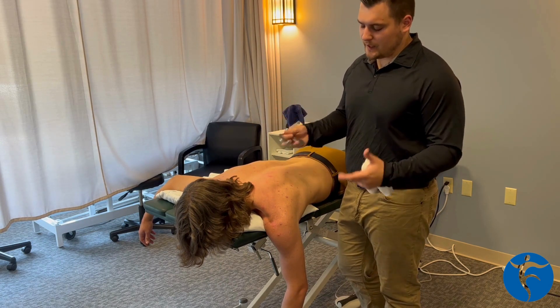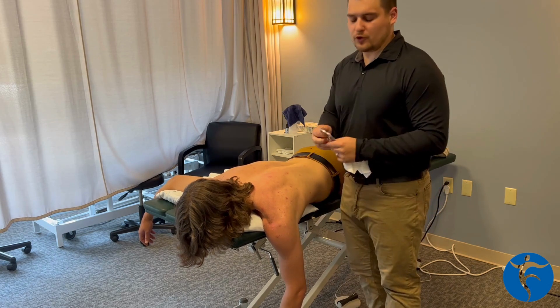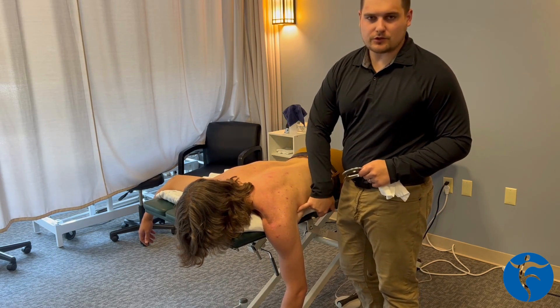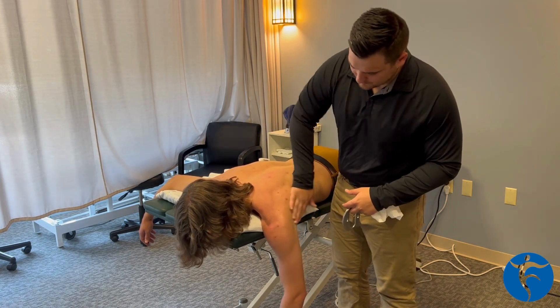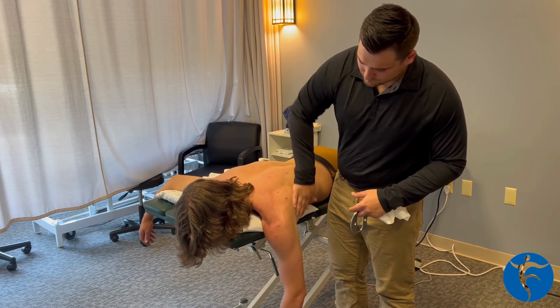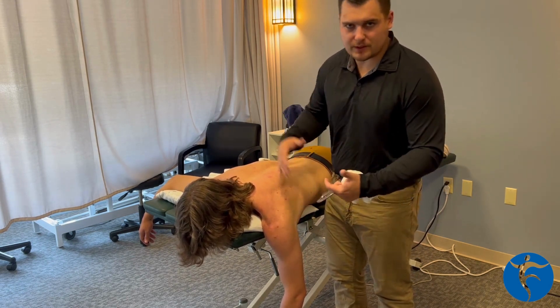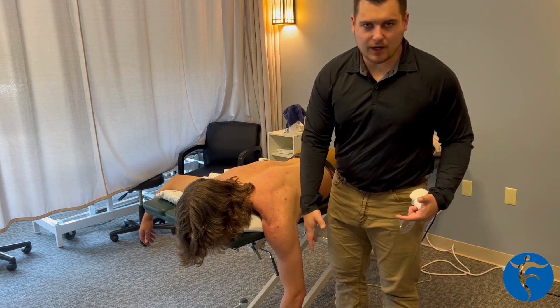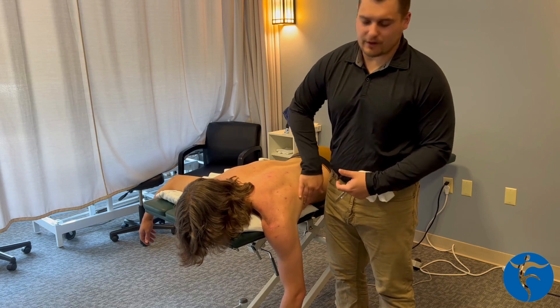I like using the instrument when we get to this point because it saves my hands and it's able to give a more uniform texture to get some of these trigger points out. First, we're going to lubricate the skin so that the instrument slides better. You want to make sure that the patient is comfortable. It doesn't really matter what position they're in, as far as arm hanging off the table a ton or a little bit. You just want them comfortable because if they're not comfortable, you're going to fight through muscle.